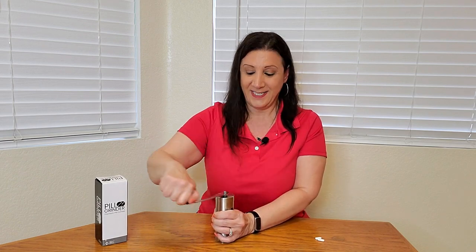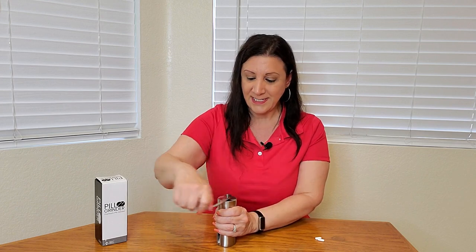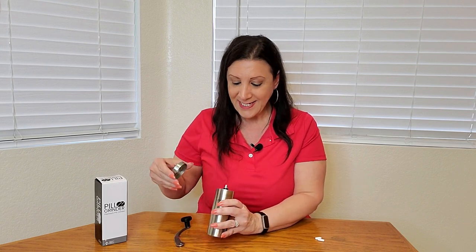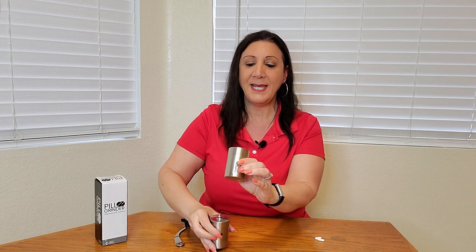And now we start grinding it. Every so often do it the opposite way. You start seeing the pills inside. It may already be done because I'm not feeling any more resistance. Since I'm not feeling any more resistance I'm going to take off the top handle and peek inside. Yep, it's all gone and grinded. So now I'm going to open the bottom up and you're going to see that it's all ground up.